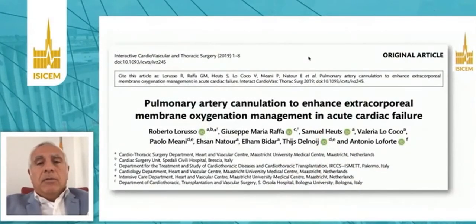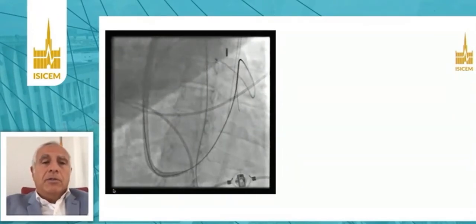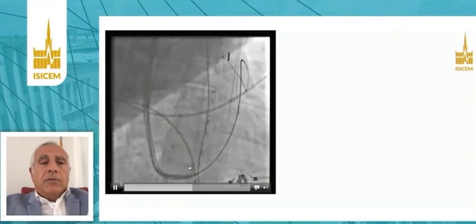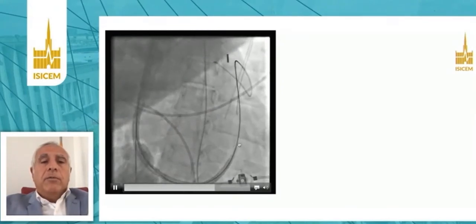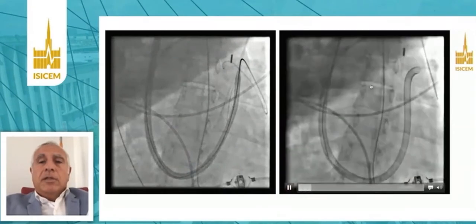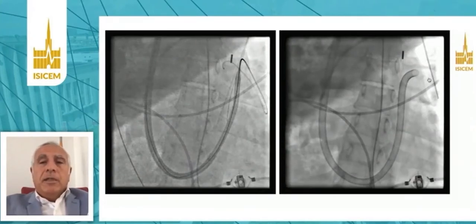But not only that, we now have some different kinds of support approaching something that in the past was thought really unfeasible. Now we are approaching the pulmonary artery through a percutaneous approach, and this really makes things much easier to support the patient in acute cardiogenic shock, sometimes with only right ventricular support. You can see here we reach the pulmonary artery through the internal jugular vein, and the cannula, through a guide wire, can reach, with careful implantation of course, the pulmonary artery. You can see the guide wire in the pulmonary artery. And then the cannula can start, of course, bypassing the right ventricle and perfusing the pulmonary artery. This is a new and very promising approach, used either to drain blood from the pulmonary artery or to perfuse.